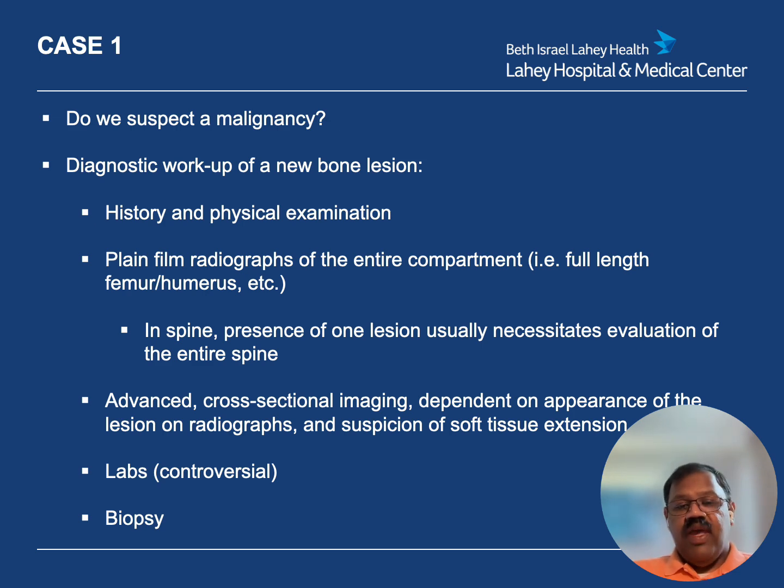So based on the x-rays, the history, as well as the MRI scan, what do we think? Is this malignant or benign? And I think all of you are really thinking that this is malignant, and if so, you're absolutely right. This has some hallmark and highly aggressive characteristics, including cortical destruction, relatively rapid growth, extraosseous soft tissue component, all of which are suggestive of an underlying aggressive process. And so you're absolutely right that this is probably malignant in nature.